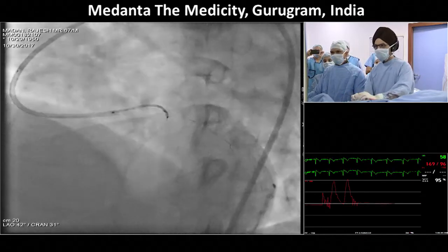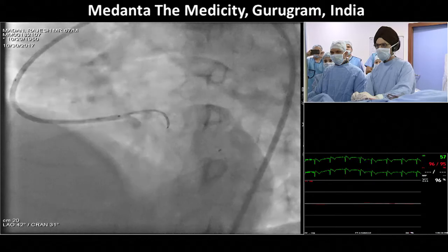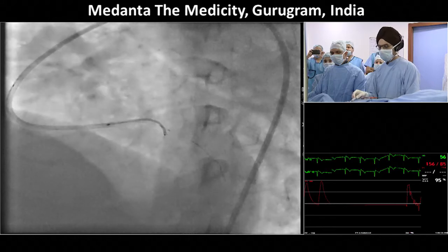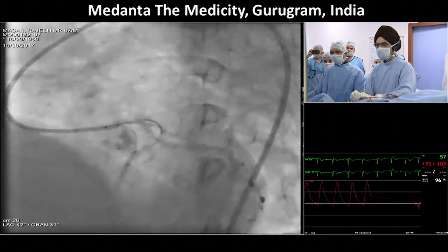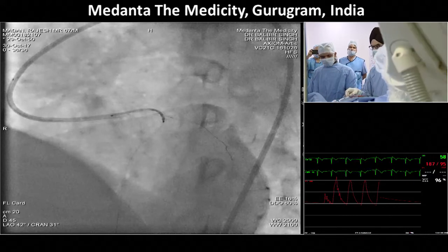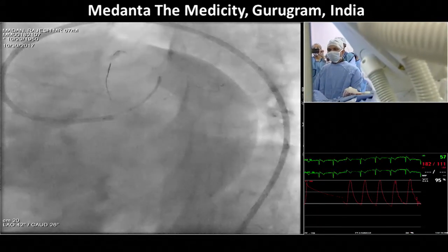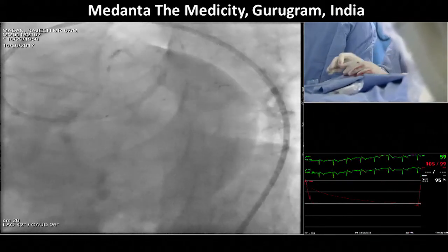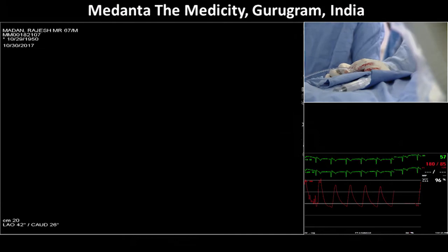Okay. Another important thing is that if we are using a long stent like this, especially if the lesion is even longer than this, for example, the longest stent in the world, a 60 millimeter tapered stent, one thing that we have to consider is the left ventricular function, because if we inflate or deflate a long stent, it will take time. So if the left ventricular function is compromised, we have to be very careful with inducing global ischemia of the left ventricle. That's also a very important learning point. I mean, keep the inflation short, right, Dr. Santoso?